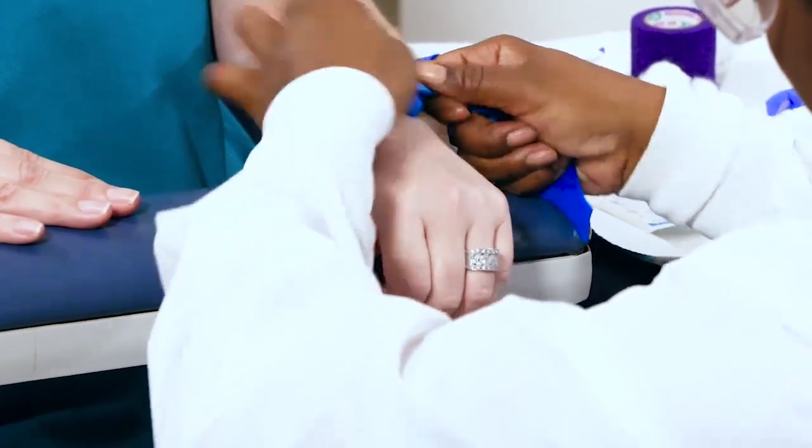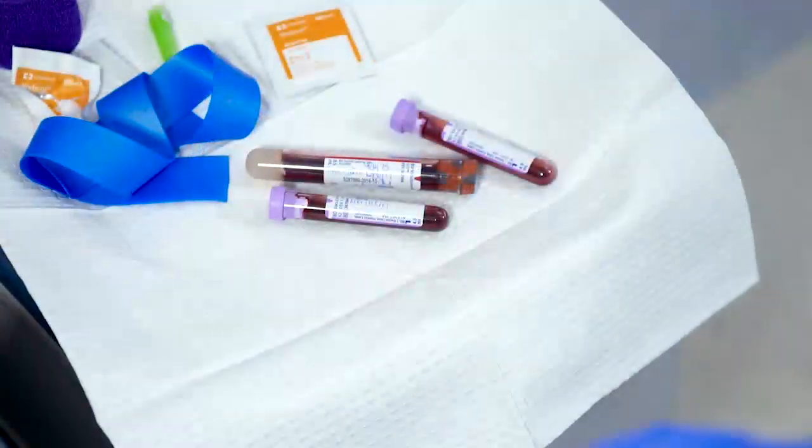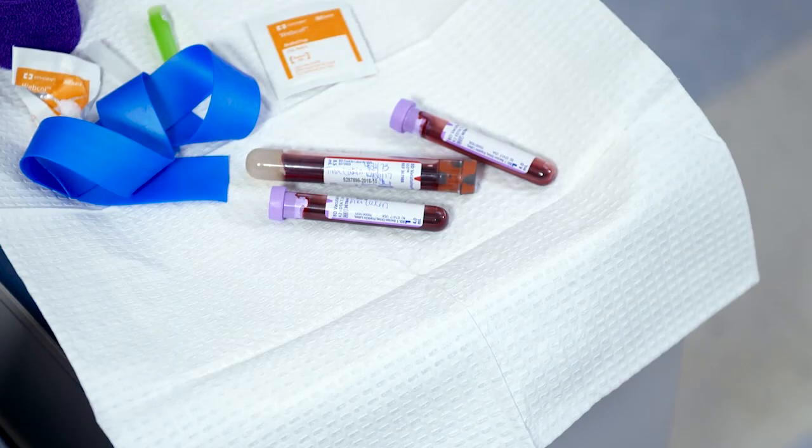In this procedure, you will learn how to obtain a venous sample from a hand using a butterfly needle with the vacuum tube method, or from an arm using a syringe method.